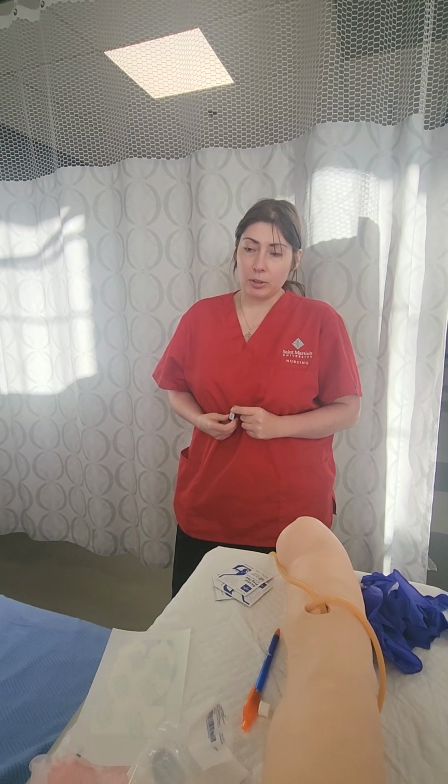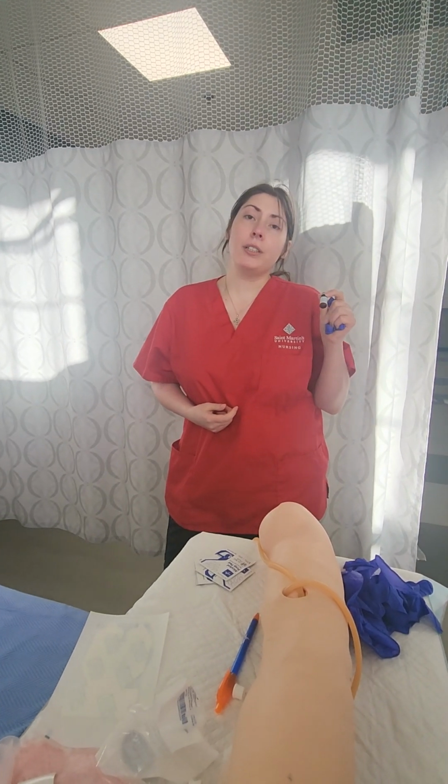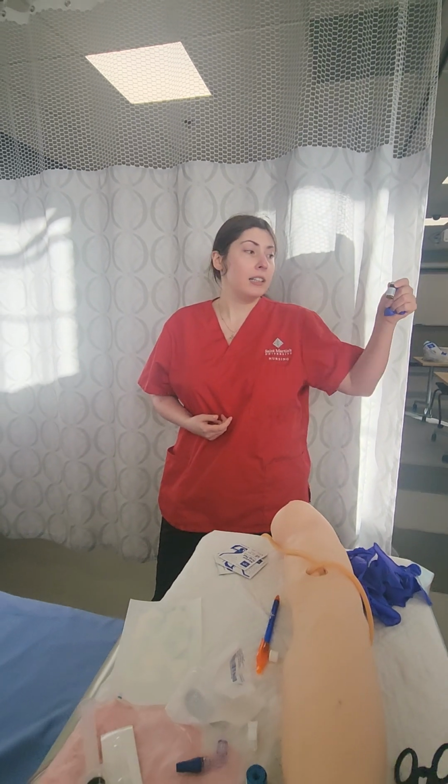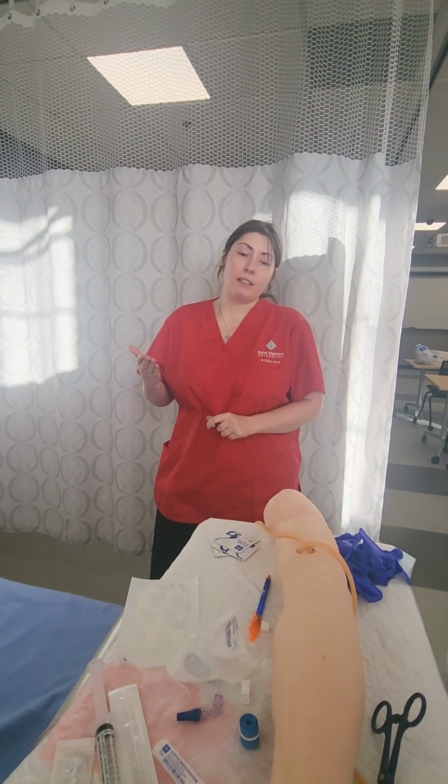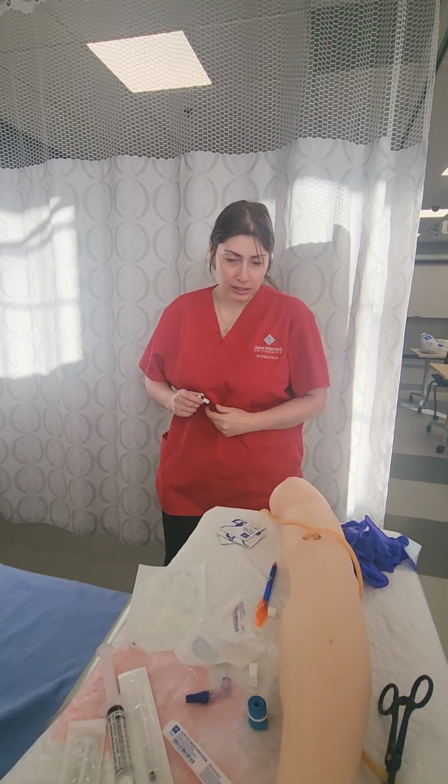I'm also going to double check that this does not need to be diluted, and I'm going to double check the safe dosage ranges.